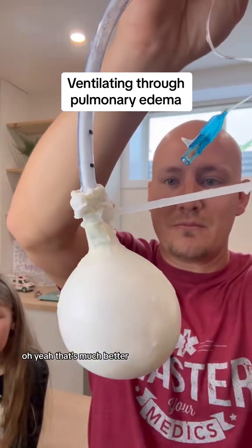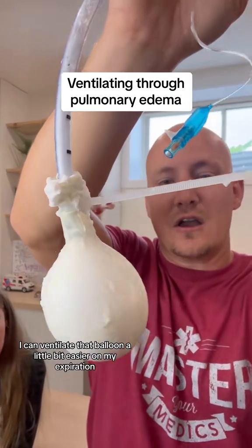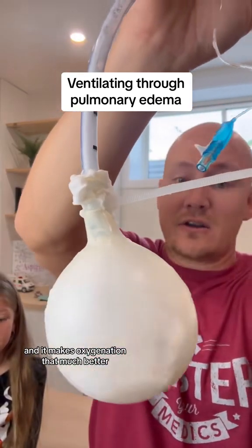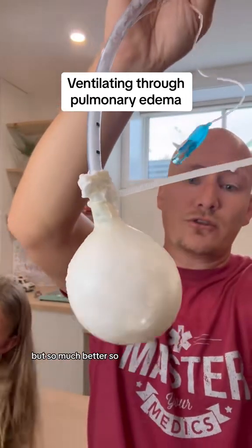That's much better. As you can see, I can ventilate that balloon a little bit easier. On expiration I'm not losing as much of that recruitment, and it makes oxygenation that much better. Not great because we still have a lot of pathological process in here, but so much better.